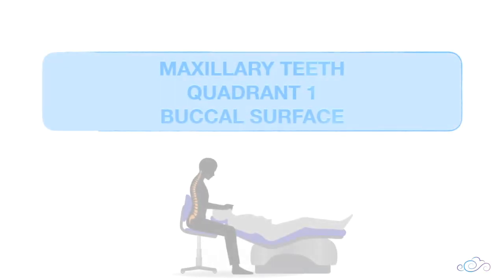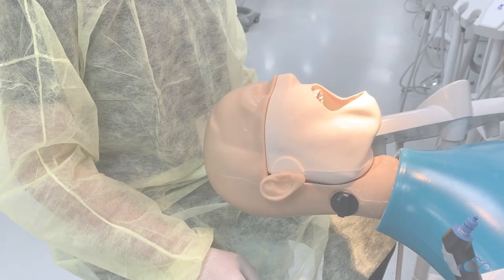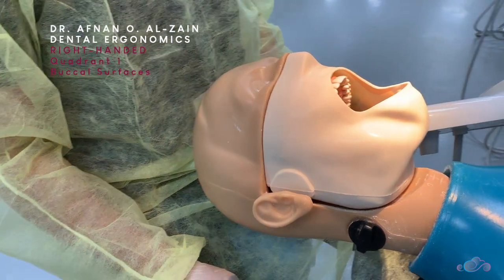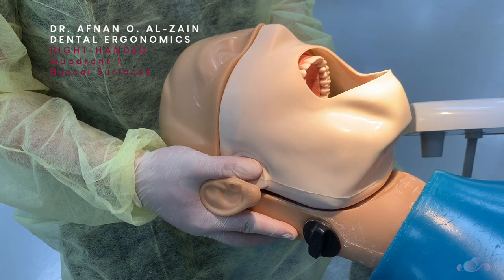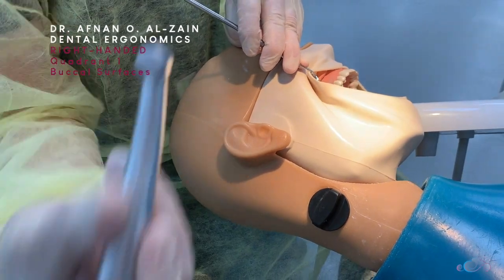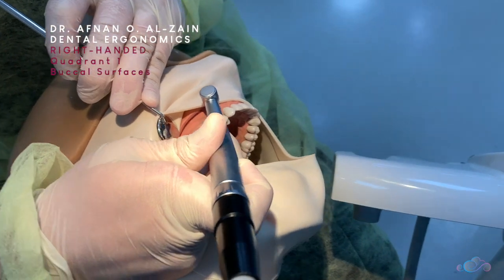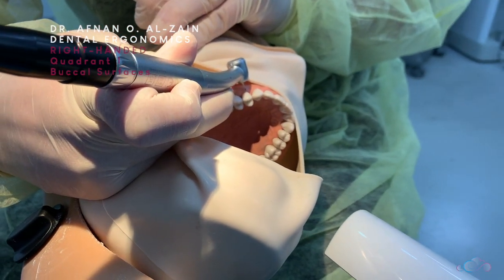Moving on to the buccal surfaces of the maxillary teeth of quadrant one. To work on the buccal surfaces of quadrant one, you're going to tilt the dummy head a little bit to the left. Then retract the soft tissue, place proper finger support on the teeth, place the burr perpendicular to the surface, and start working with direct vision.